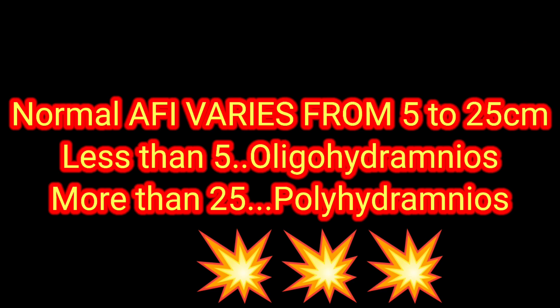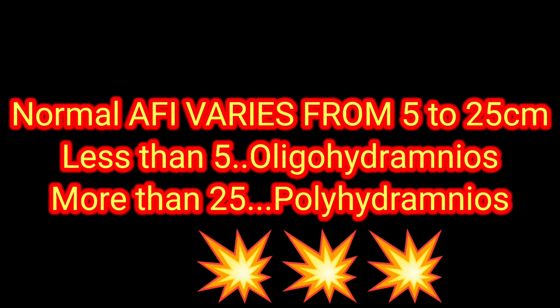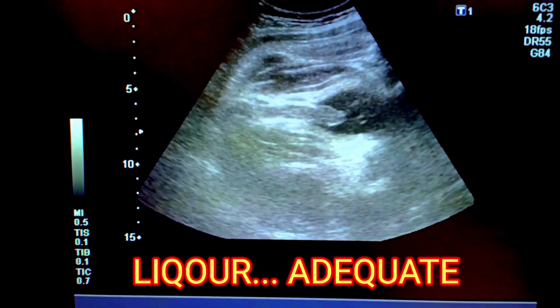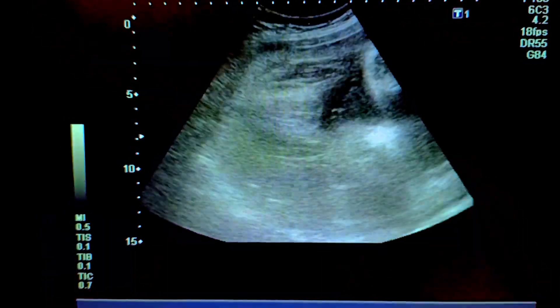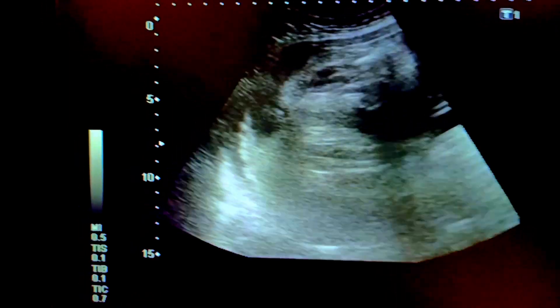The AFI — amniotic fluid index — varies from 5 to 25 cm. If it is less than 5, then it is oligohydramnios, and if it is more than 25, it shows polyhydramnios. Again, coming to the live case: we measure the AFI in the four quadrants of the abdomen to measure the amniotic fluid index.